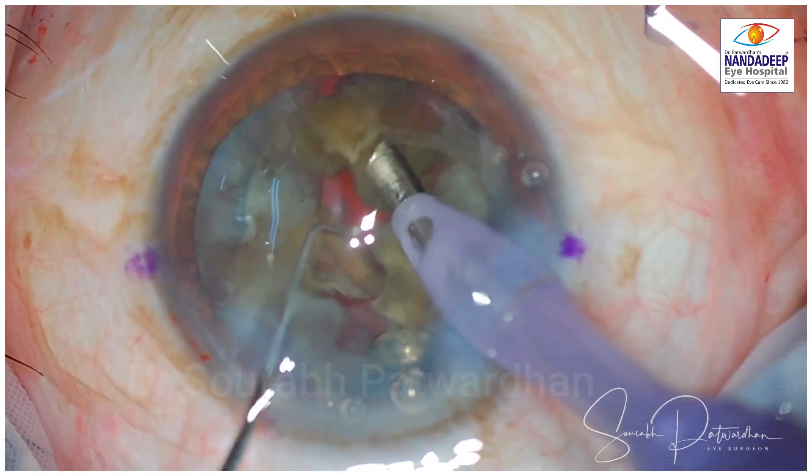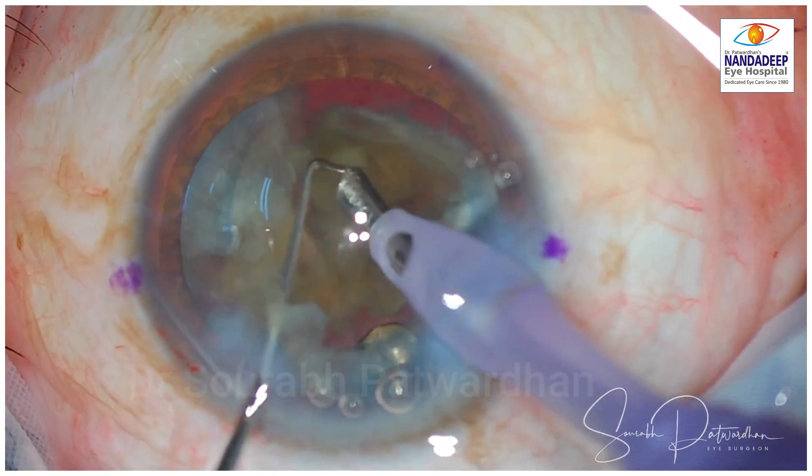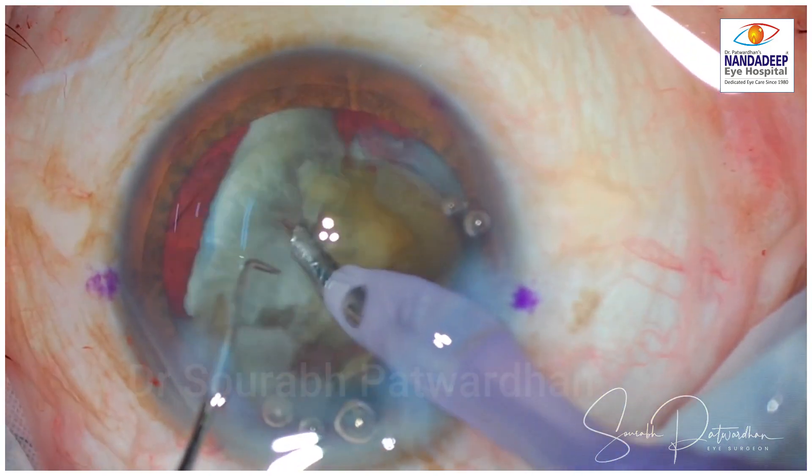This is a hard cataract but a brittle one — it cracked very easily and nicely, and could be emulsified quite successfully.